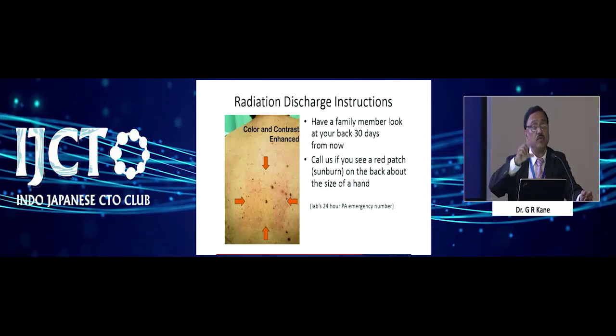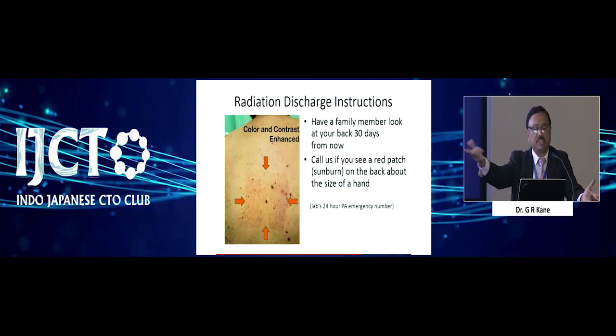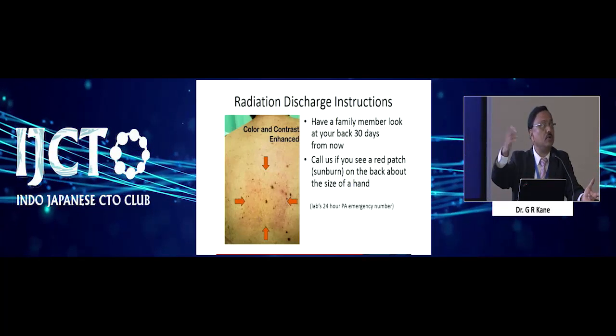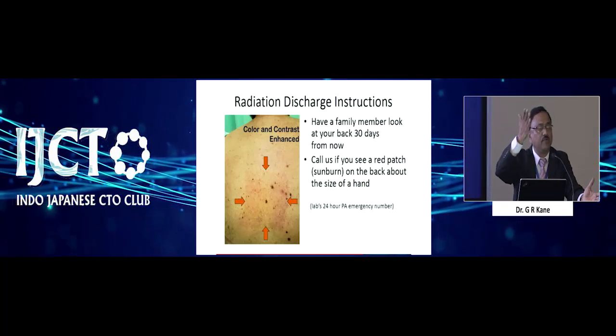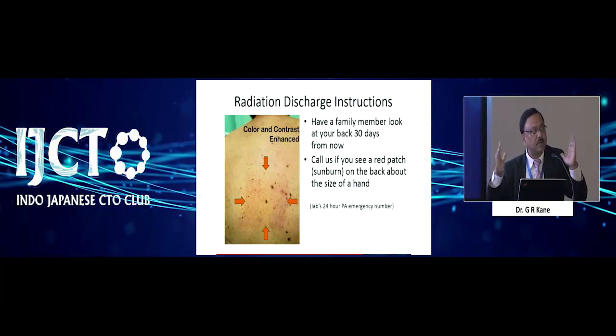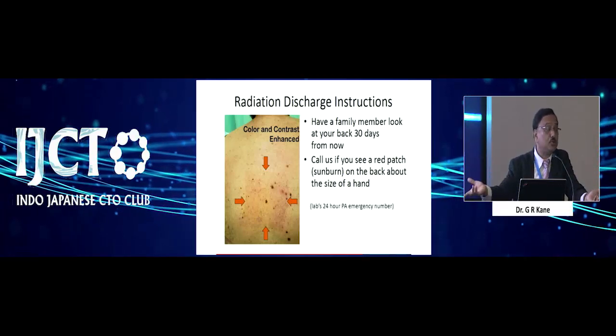One of the ways of reducing this, I'll tell you something which I did, which I realized I had done wrong. The view in an LAD ostial occlusion was only the LAO caudal. You could see it in only that view. I worked for almost an hour, and then I realized, what am I doing? The patient is irradiated in the same view all the time, in one particular view, because the other views don't show you that lesion.